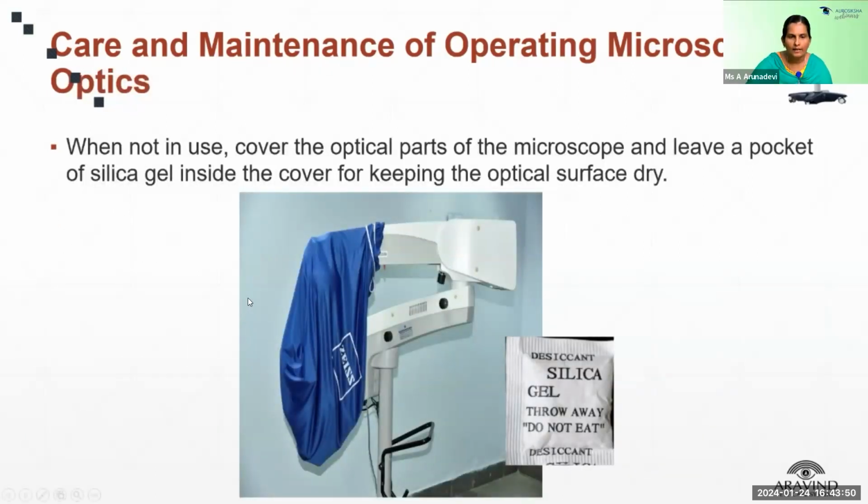When the machine is idle, please put the dust cover on, along with a silica gel pack inside, for keeping the optical surface dry.